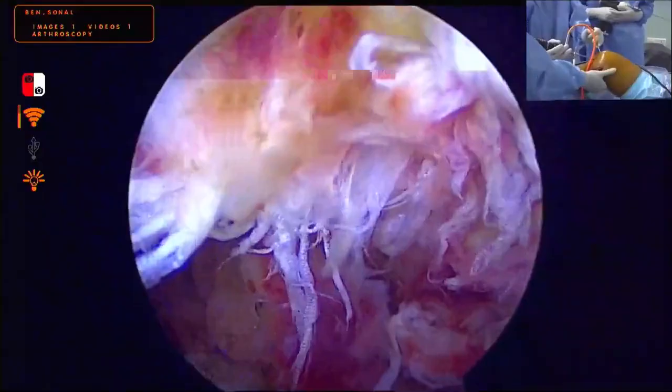Here we have not taken any graft. We have done a primary repair of the MCL, we have done a primary repair of the PCL, and that is also in a double row fashion. So you can see that we have inserted a push lock here. We have inserted 2 X-fix anchors here. We did a double row classical repair for the PCL, and then we have done a knotless repair for the ACL. So different techniques we have used, but eventually we have achieved a good normal anatomical picture of repairing primarily all the 3 ligaments. This is contrary to what the book is teaching, but follow my words.